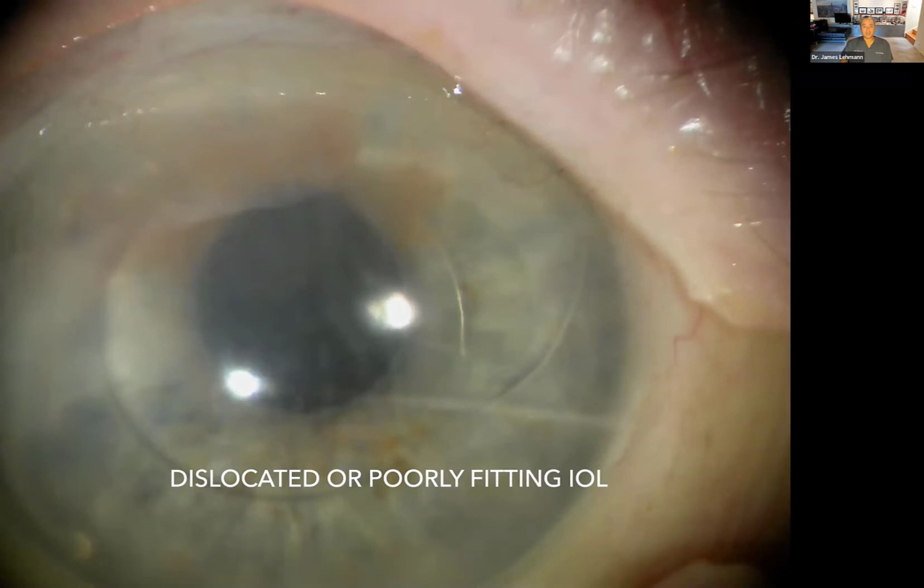What if you had a dislocated or poorly fitting IOL? So if you look at this picture, what you see is an edematous cornea with some vascularization, and you see a one-piece acrylic IOL in the anterior chamber. So that's a no-no. In this situation, I would not do this all combined.